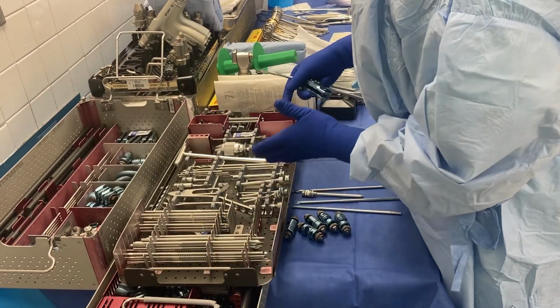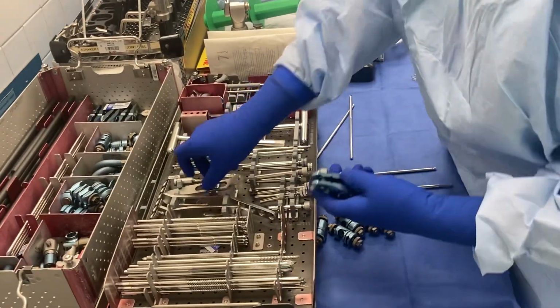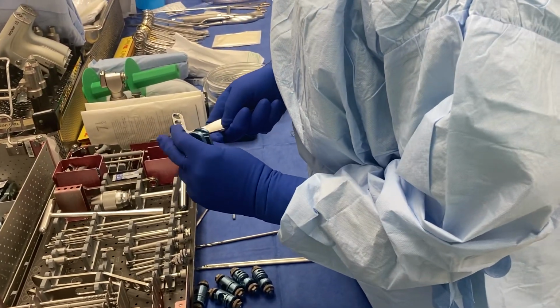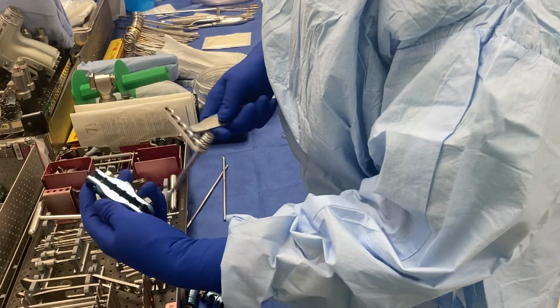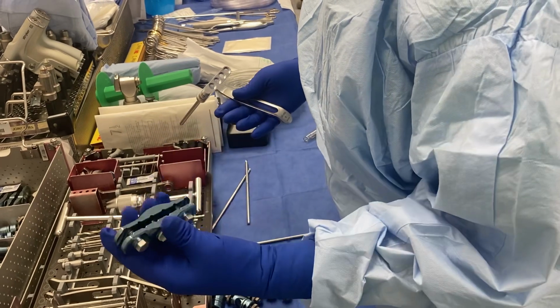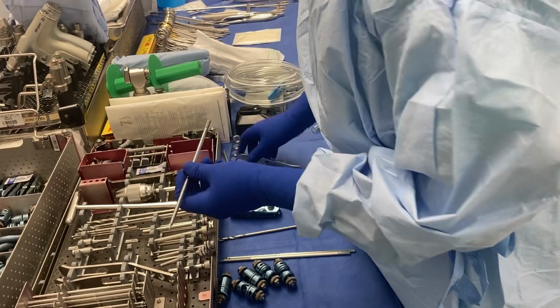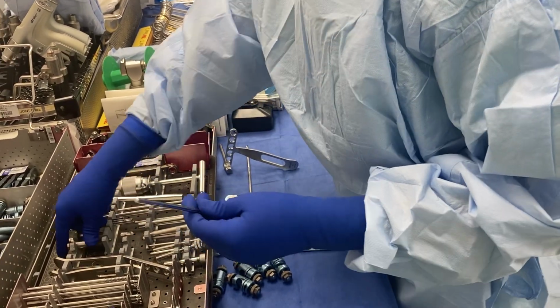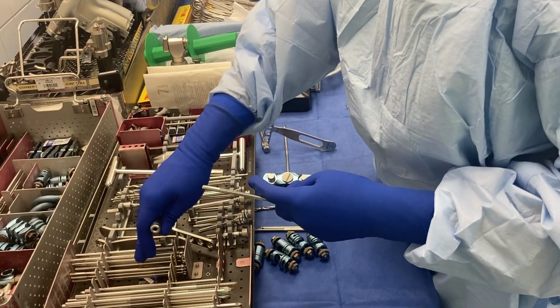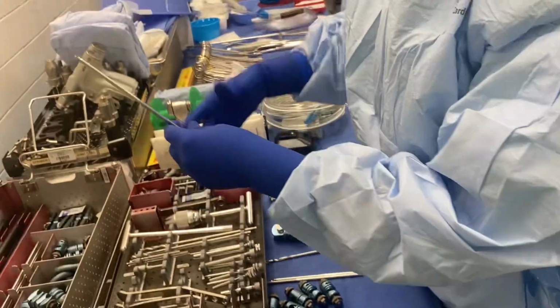In the top here, just briefly, if they want to use the 6-pin, which is in my hand here, a lot of times they'll use this guide with your drill guide, because it lines up perfectly to all these little pins. So some doctors use this, and then they'll use this guide if they want to use the 6-pin guide. And then these Schanz pins, you either have to chuck them on the drill, or you can use a quick connect. There's 5.0 and 4.0. We have 4.0 pins in here if they want to put a pin in the foot. But these just go right in there, and then they attach to our drill.